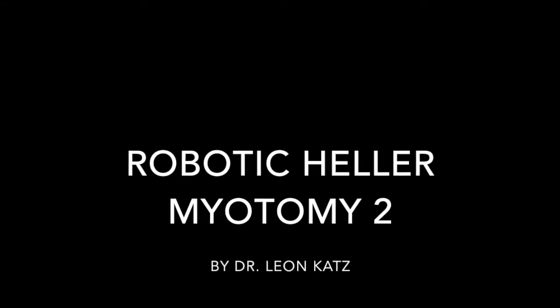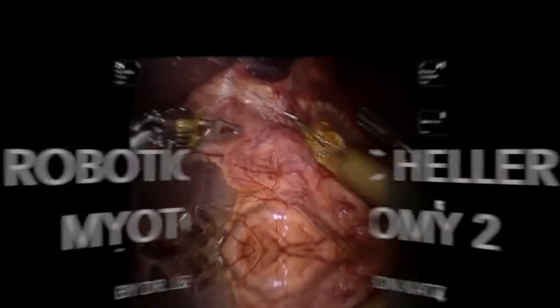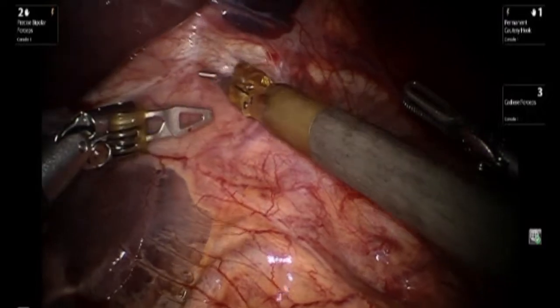This movie demonstrates the Heller myotomy being performed for achalasia.